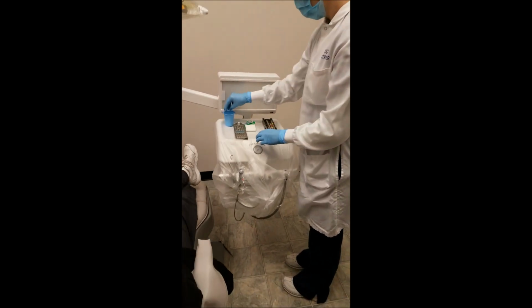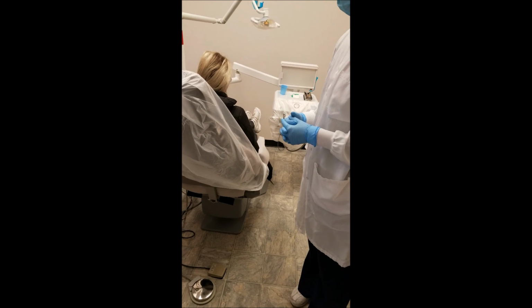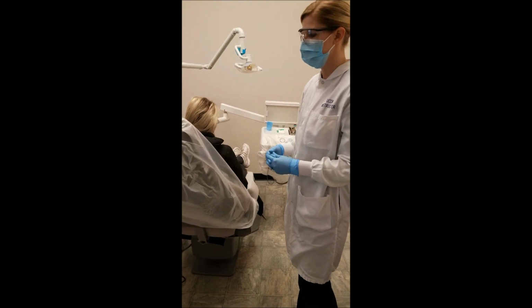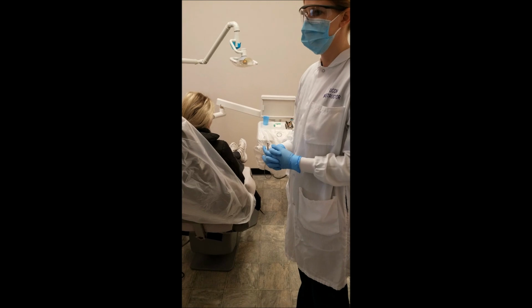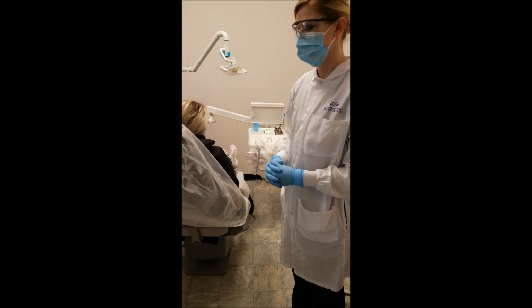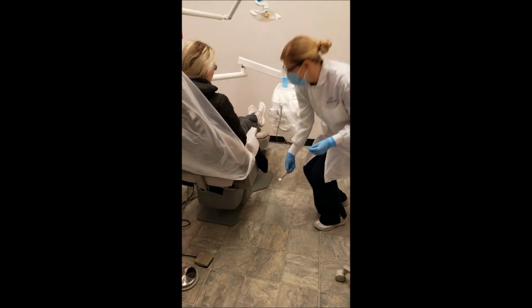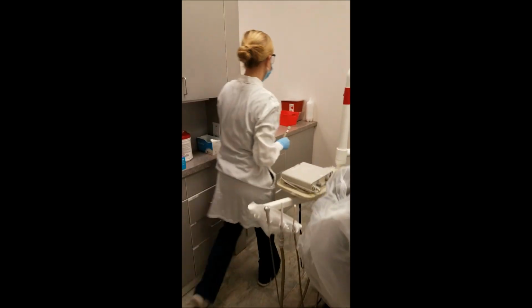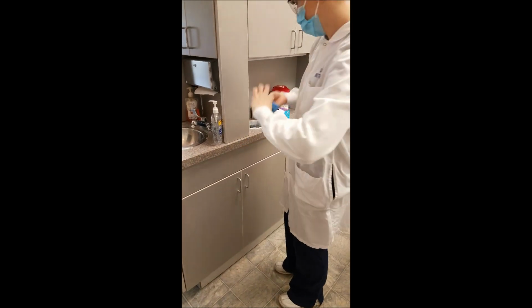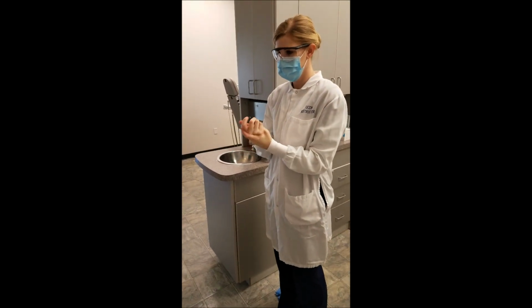Then she will always remove and discard gloves and wash hands or use sanitizer when accessing supplies in the drawers or cupboards, or when she's leaving the dental operatory, or after performing intraoral procedures and or handling the patient's permanent chart. She will always rewash hands or use hand sanitizer and re-glove when returning to the operatory if intraoral procedures are to be continued. She will pick up any dropped instruments with gloved hands and place them in the red contaminated bin in the team area. Then she will deglove, wash hands or use hand sanitizing rub, and then she would re-glove when she returns to the treatment area.